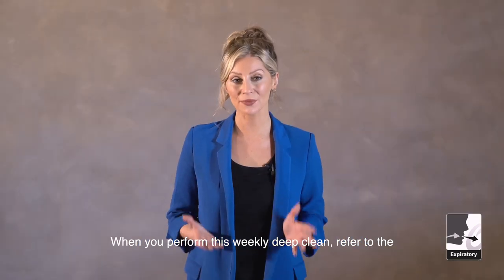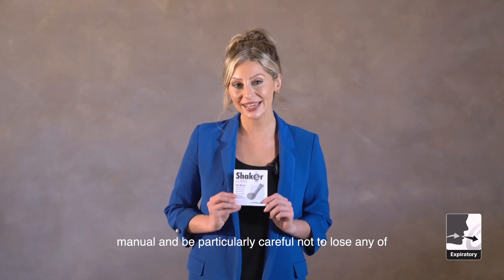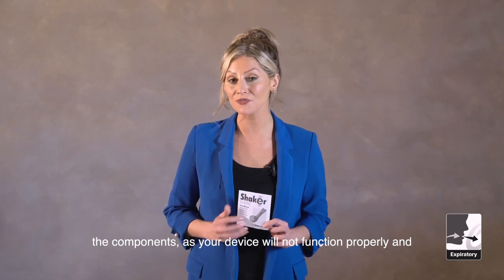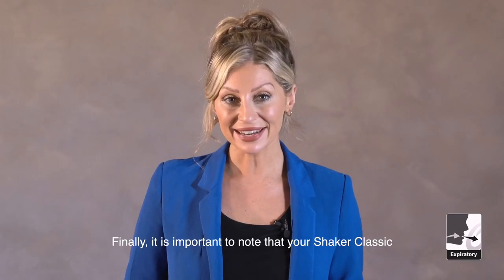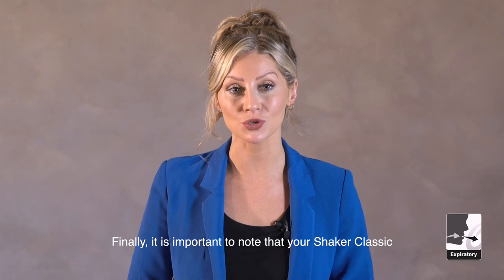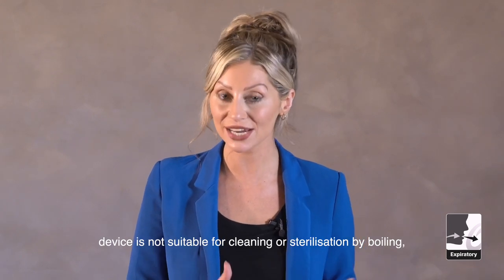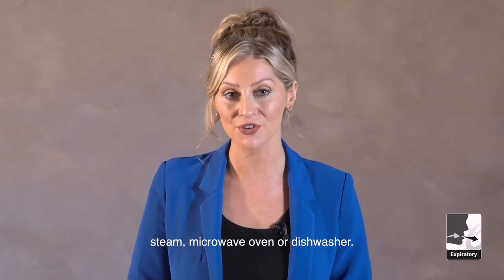When you perform this weekly deep clean, refer to the manual and be particularly careful not to lose any of the components, as your device will not function properly and could become ineffective. Finally, it is important to note that your Shaker Classic device is not suitable for cleaning or sterilization by boiling, steam, microwave oven, or dishwasher.